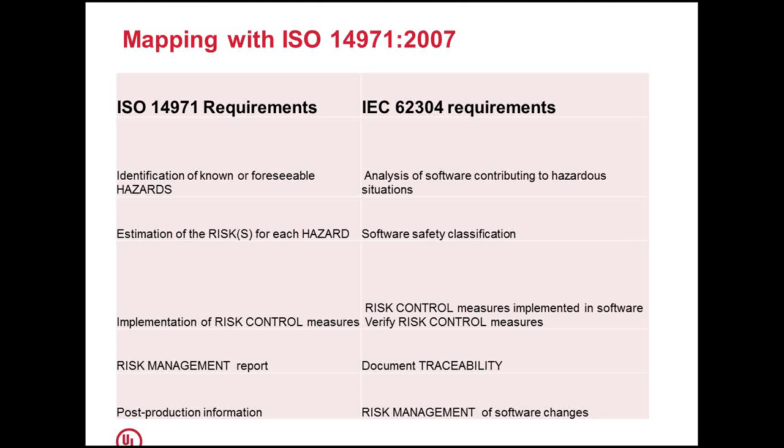So these are all the main requirements in the risk management process. How is this linked with the requirements in the SDLC standard?